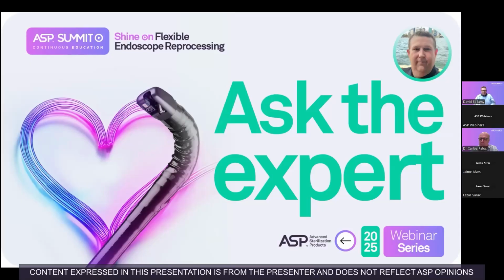I think that it's a good part to have. For me and for what I see in the future, with the complexity of these devices, us not being able to visually inspect these lumens, I think HLD will go hand in hand with sterilization. So it will be an HLD process followed by sterilization, and that just gives better assurance, better compliance, and patient safety overall. So for myself in my own facility, I sterilize our bronchoscopes and things like that after high-level disinfection. So I'm hoping it would increase and be incorporated with sterilization.